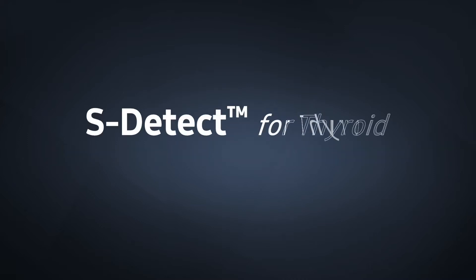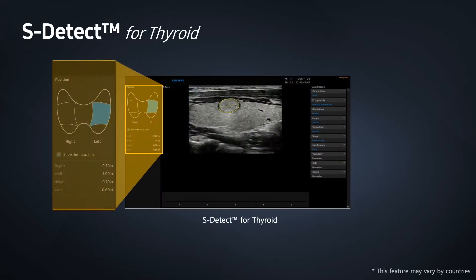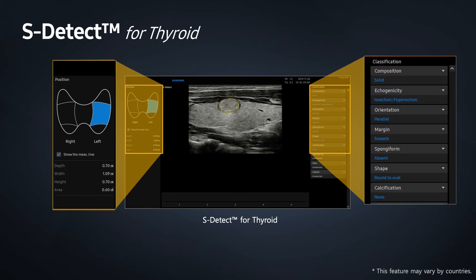S-Detect performs a semi-automated analysis of selected lesions documented within the thyroid ultrasound examination. Characteristics of thyroid lesions are then displayed using a standardized reporting format based on established clinical guidelines. The combination of semi-automation and standardized analysis helps to maintain consistency of documentation and streamline workflow.